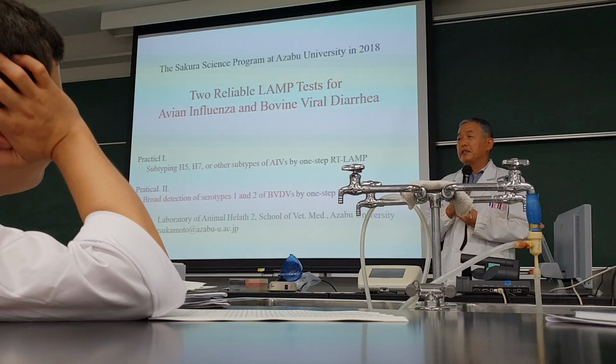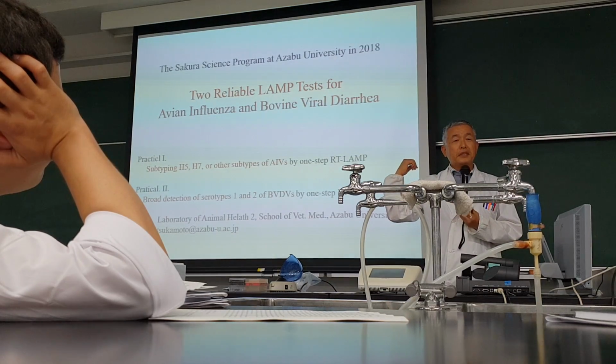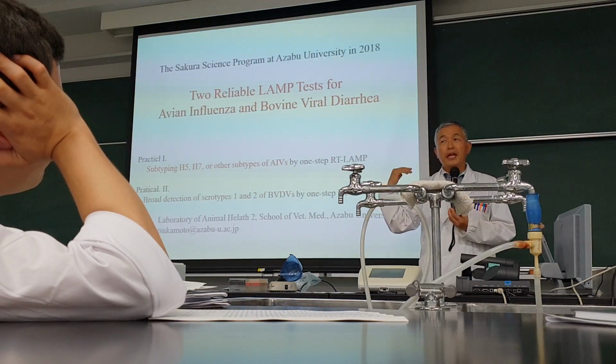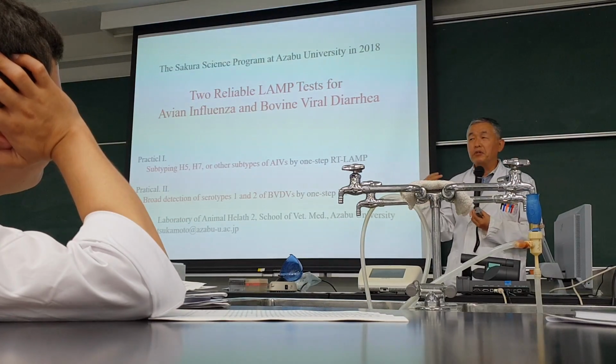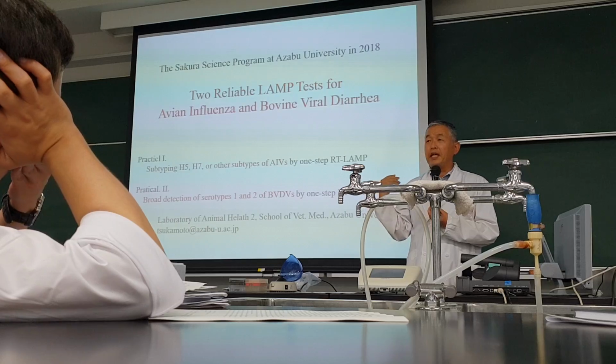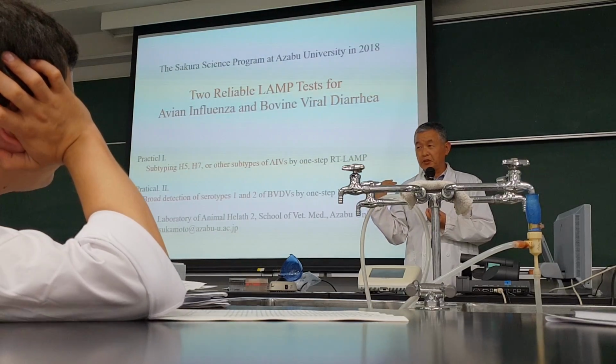And then we have the system for influenza H5, H7, and common type A, the common NPA LAMP test.